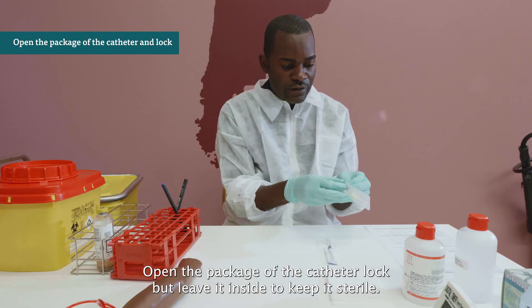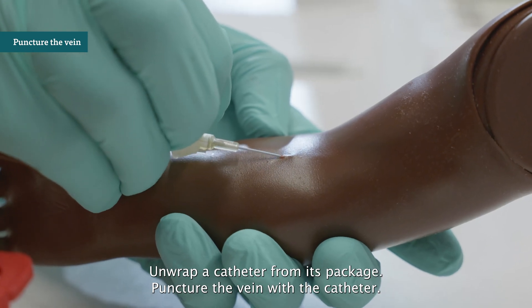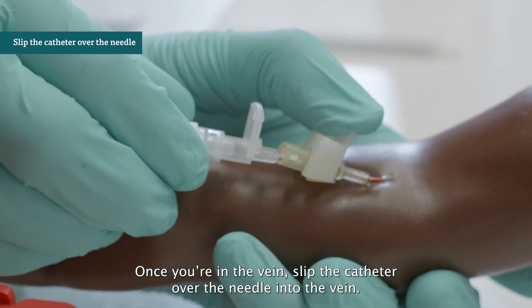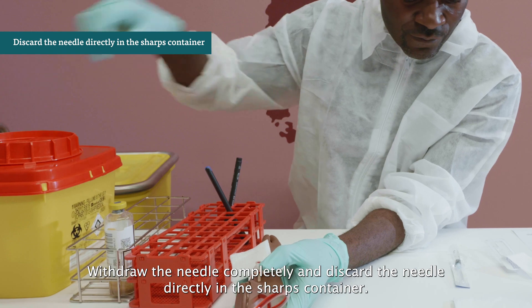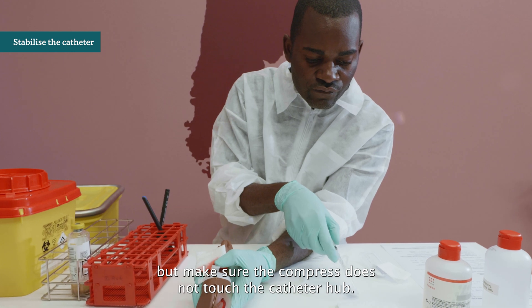Open the package of the catheter lock but leave it inside to keep it sterile. If you want to use a tourniquet, fasten it now. Unwrap a catheter from its package and puncture the vein with the catheter, but do not touch the puncture site. If you have touched the puncture site, repeat antisepsis before proceeding. Once you are in the vein, slip the catheter over the needle into the vein. Take a dry sterile compress and put it under the needle on the skin of the patient. Withdraw the needle completely and discard it directly in the sharps container. If catheter insertion failed, use a new sterile catheter and a new puncture site and repeat the procedure from antisepsis onwards. Stabilize the catheter with a small tape during the whole procedure, but make sure the compress does not touch the catheter hub.